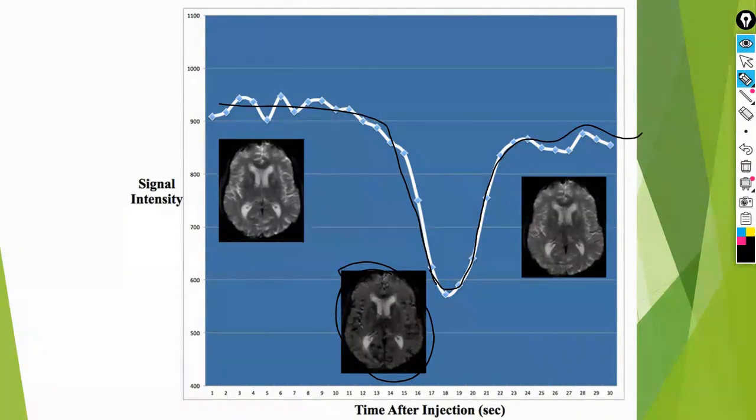This is what I'm doing, guys. This is the perfusion. You take a fast sequence on a specific organ. You take it before the contrast agent and during it. For example, every second, you take an image of something and it gives you the hemodynamics for those organs.